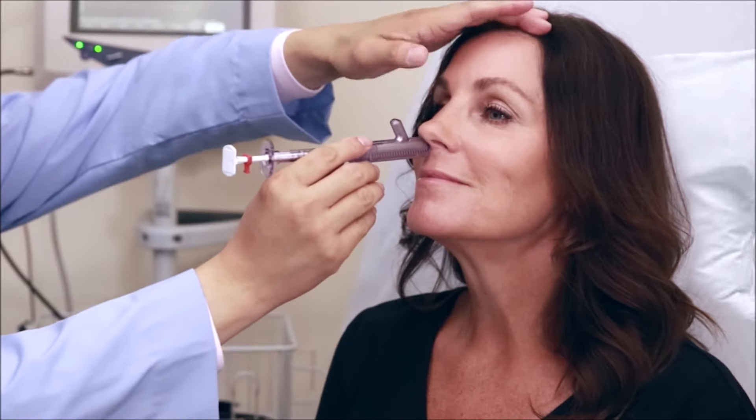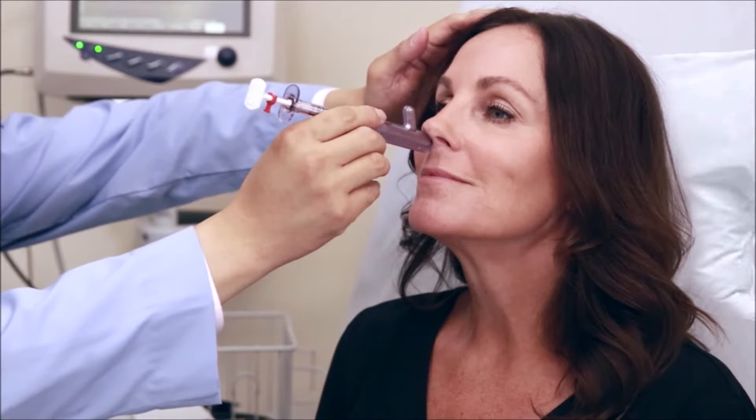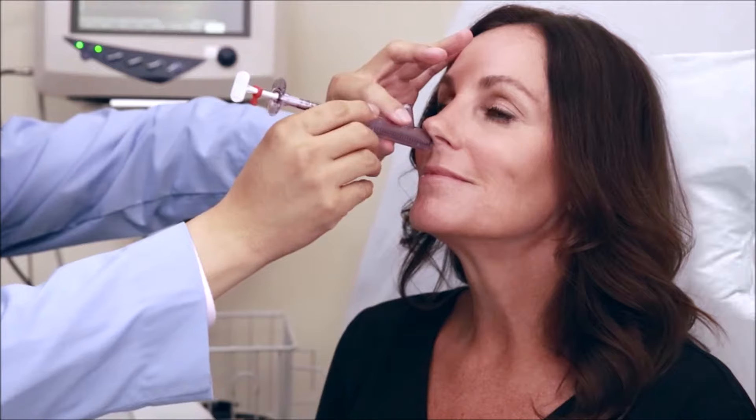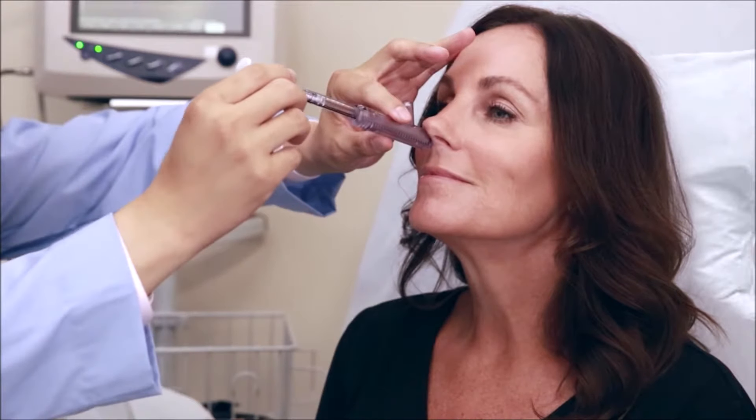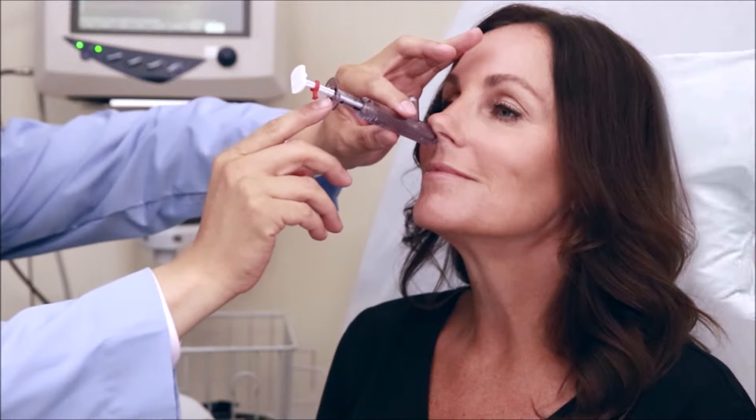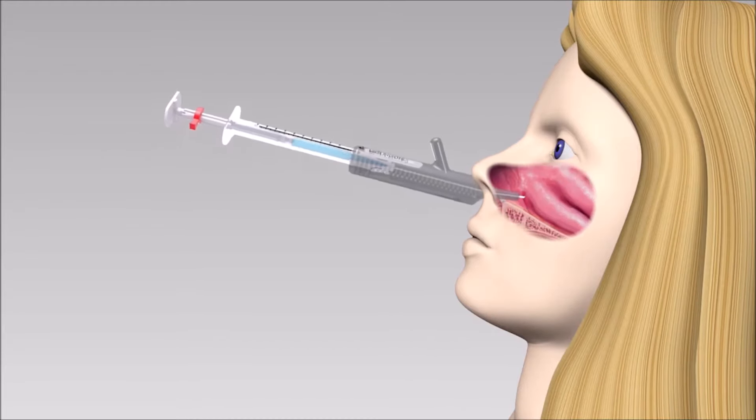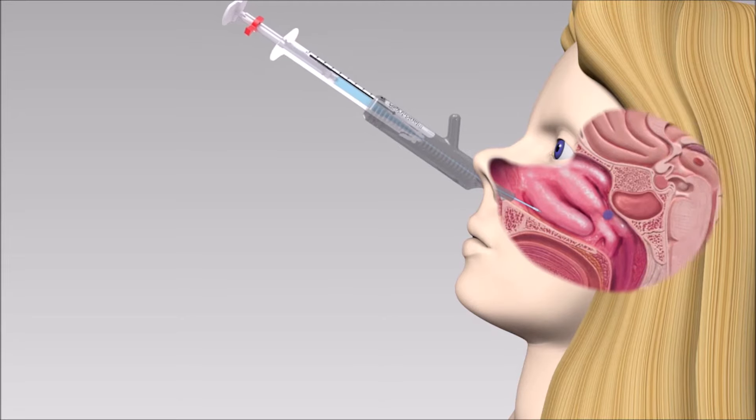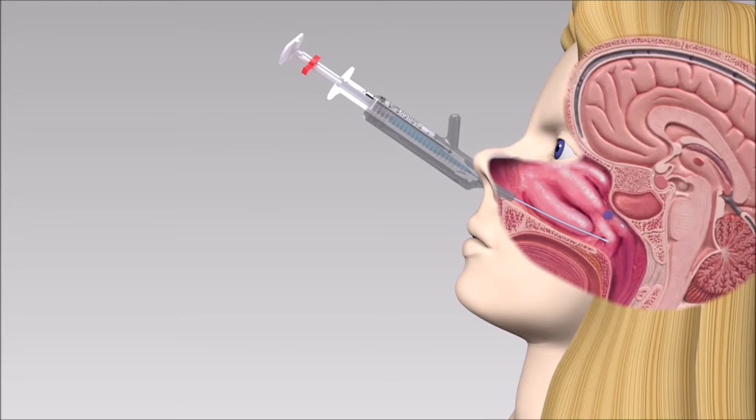The next step is to hold TX360 in this position with your non-dominant hand and hold the syringe with your dominant hand. Then gently push the entire syringe into the body of TX360 as far as you can. The soft needle-like tip should glide on top of the floor of the nose.